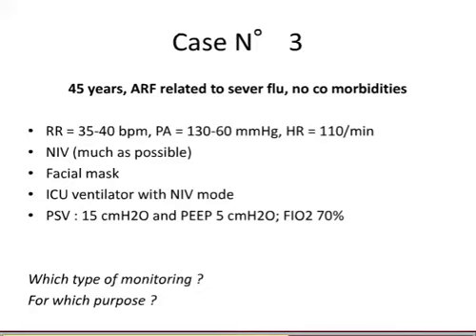So what is the purpose of the monitoring for this patient with a hypoxemic respiratory failure? What is different from the first and the second case, from your point of view? For how long is the patient on non-invasive ventilation? It just arrived with the other one. I see. So this is the starting point. It's a very busy day at the ICU. Everybody's arriving at the same time. As usual. So maybe what is the point for this patient? Do you have some suggestion?